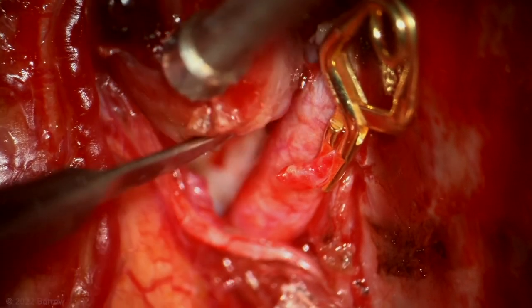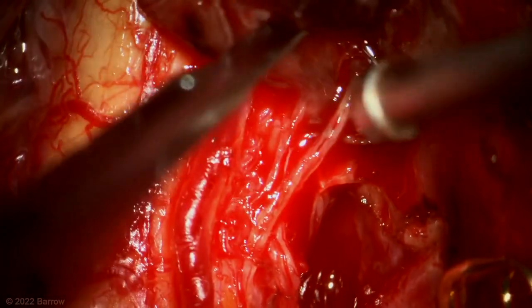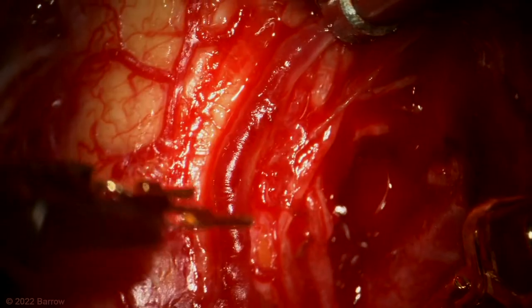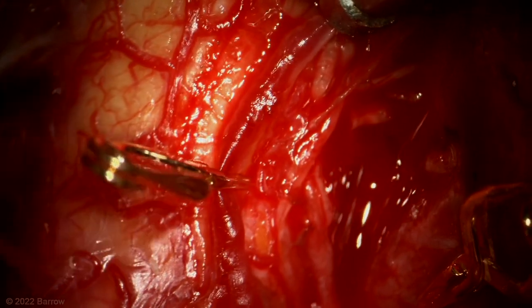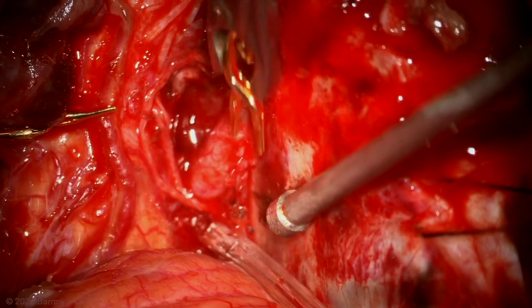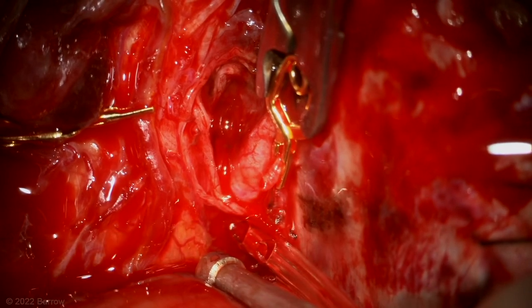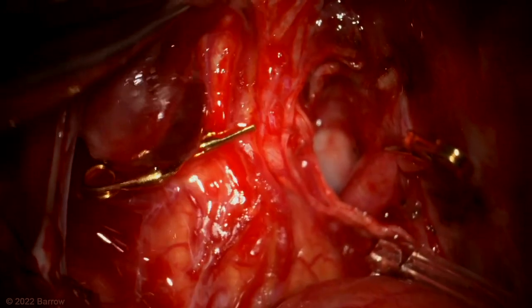The aneurysm is transected and rolled away. A distal clip is applied to the distal PICA. There is poor flow through that PICA stump — I was able to get it open, but the quality of the tissue seemed poor. So I made the decision at that point to proceed with re-implantation.